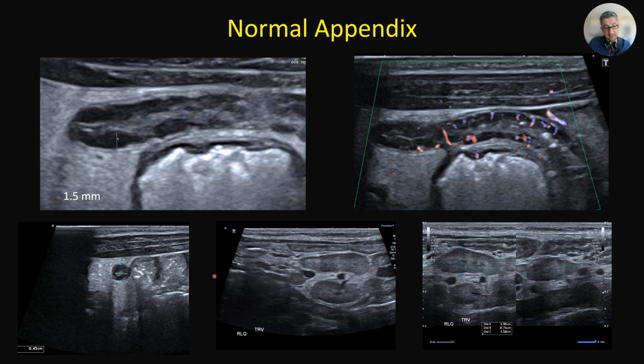So this patient, I know that it's 100% lymphoid hyperplasia because this is a 10-month-old with biliary atresia post-Kasai. And there is no clinical picture of appendicitis. And this is the ultrasound. The appendix is measuring up to 4.5 millimeters only, and this has not progressed into appendicitis.